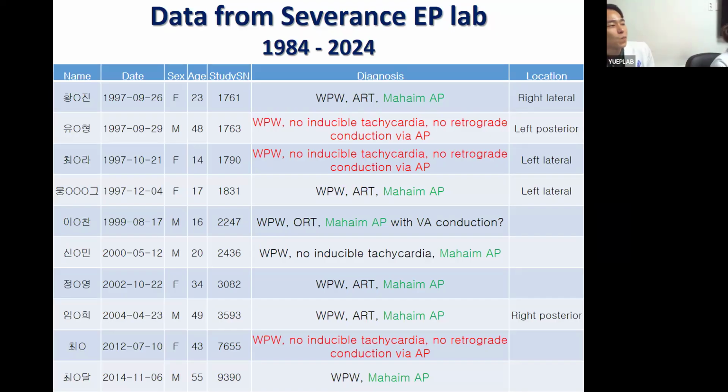저 밑에 환자는 엄선생 환자인데 아마 인덕션 안 돼서 오블레이션 안 했다고 들었어요. 네, 그죠? 맞아요. 이분 최근 팔피테이션이었어 아마. 근데 이 환자는 패드가 없었어. right side, left side. 2010년? 2012년이네. 이렇게 다 남아있으면 항목별로도 없는 부분이 되게 많아가지고.